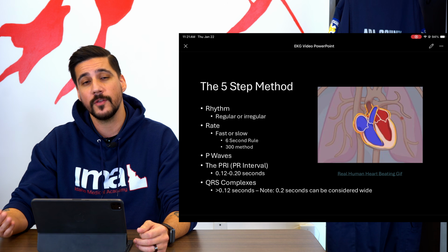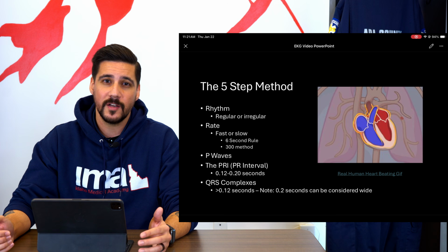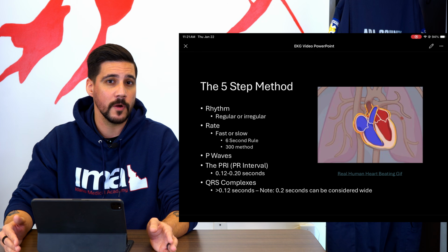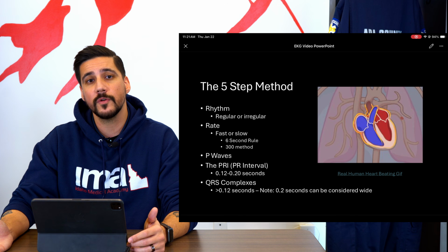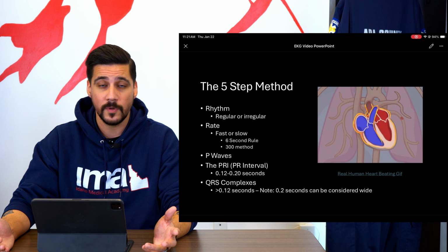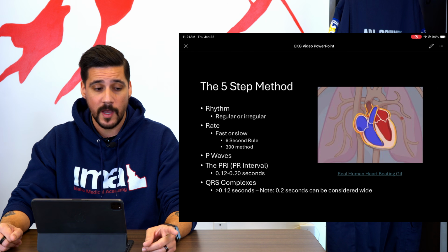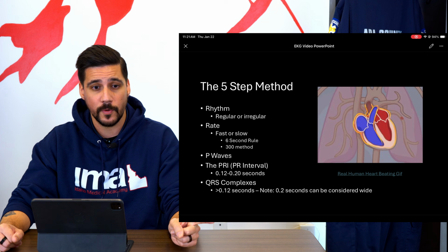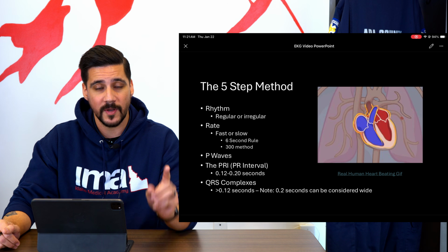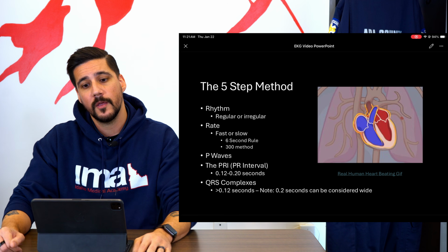And then it's something that you as a provider, if you're out in the field as an EMT basic, you're not going to necessarily be diagnosing, you're not going to be doing any of the grunt work with that, leave that to your paramedic, but there are things you can do to be helpful, right? If you put the 4-lead on somebody, which is in your scope to do, not read, but to put it on, you can feel a pulse and look at that monitor and say, yeah, okay, cool, they're lining up. I have a total of 85 beats, and my 85 beats that I'm feeling on the pulse are mechanically lined up with every electrical spike that I see there.